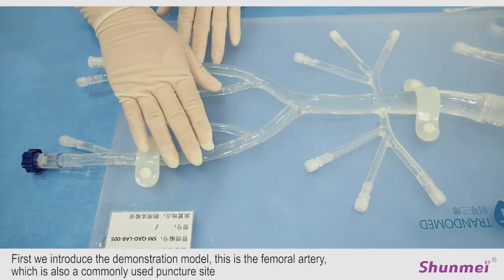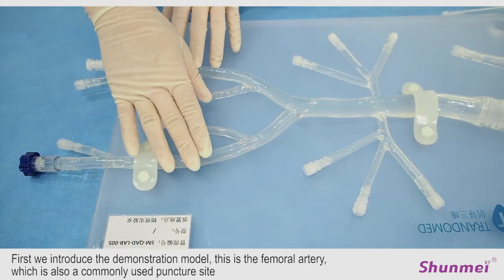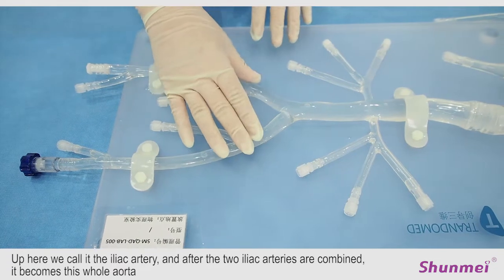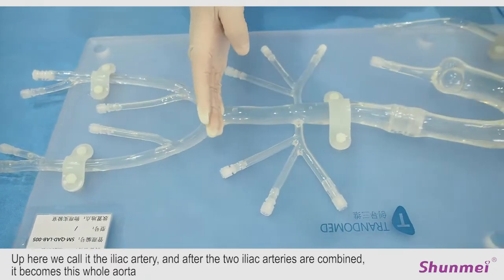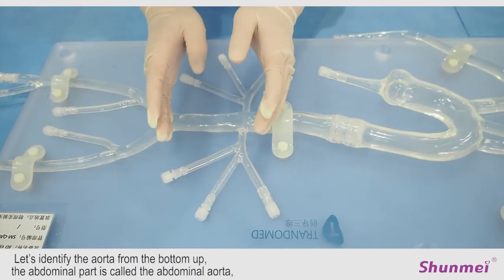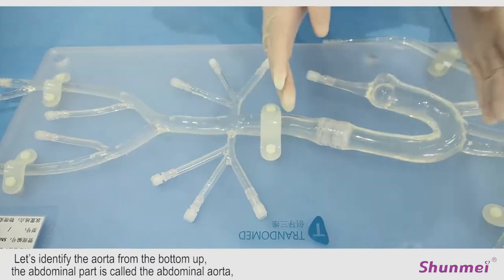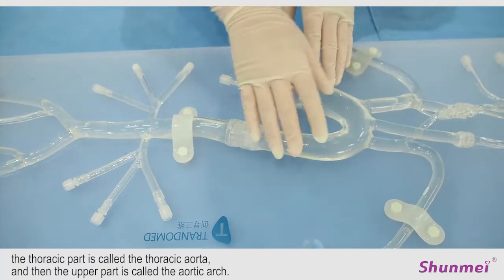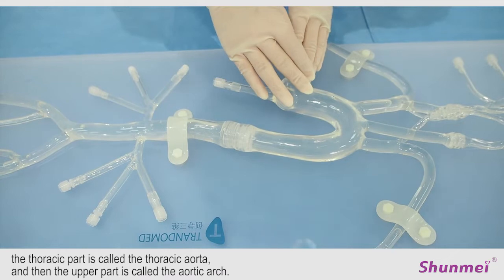This is the femoral artery, which is also a commonly used puncture site. Up here, we call it the iliac artery, and after the two iliac arteries are combined, it becomes this whole aorta. Let's identify the aorta from the bottom up. The abdominal part is called the abdominal aorta, the thoracic part is called the thoracic aorta, and then the upper part is called the aortic arch.